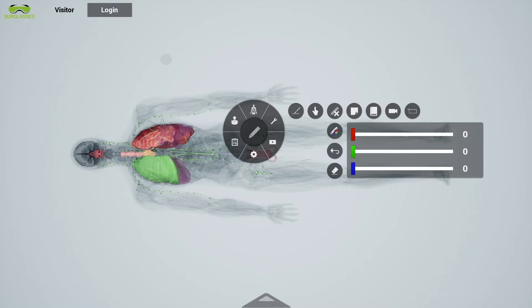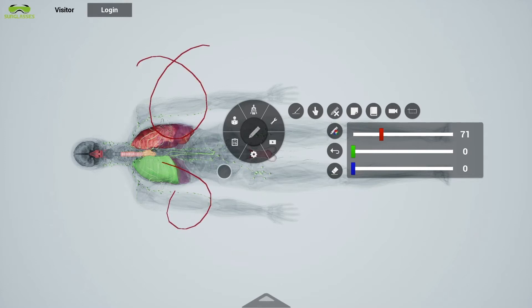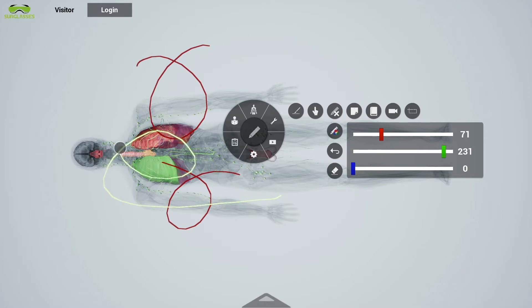In addition, professors can take out a specific body part and change its color for better understanding of the specific human anatomy.